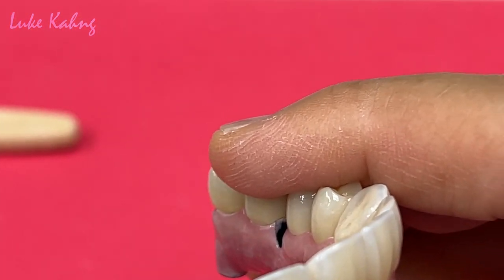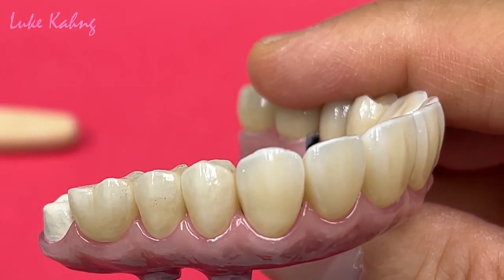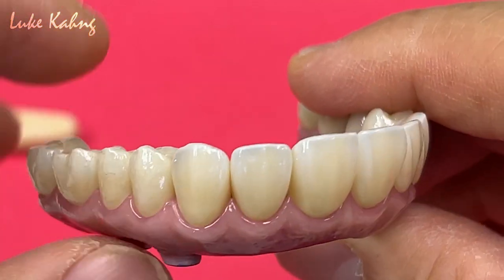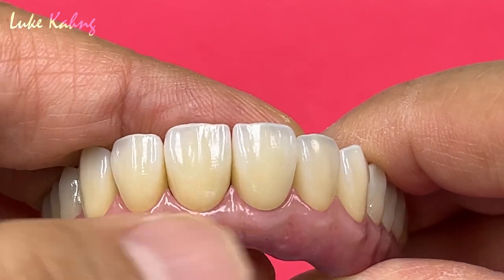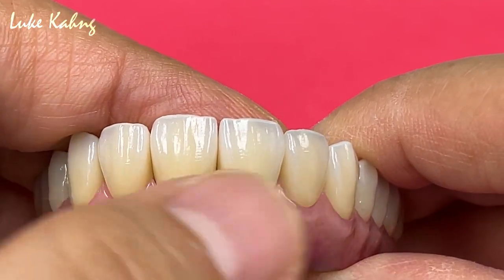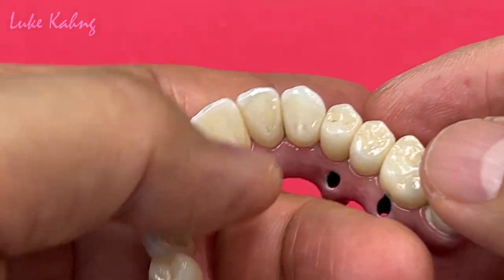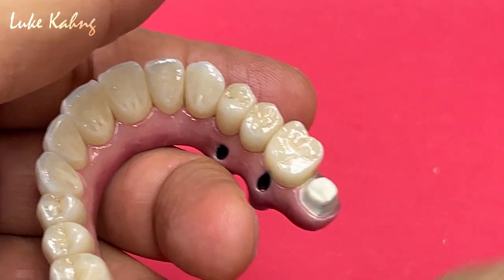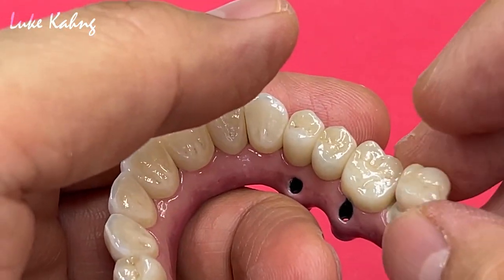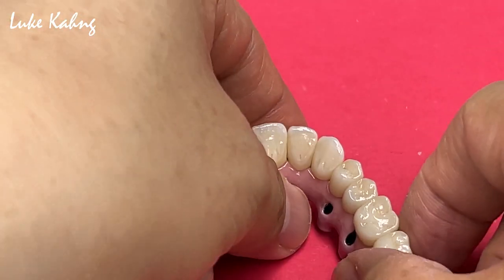It's very imperative before we go to cement. So we have to cement central first, and then canine cement, and the lateral, and then premolar, and molar. That one is deep. Before we go to the finals, cementation.